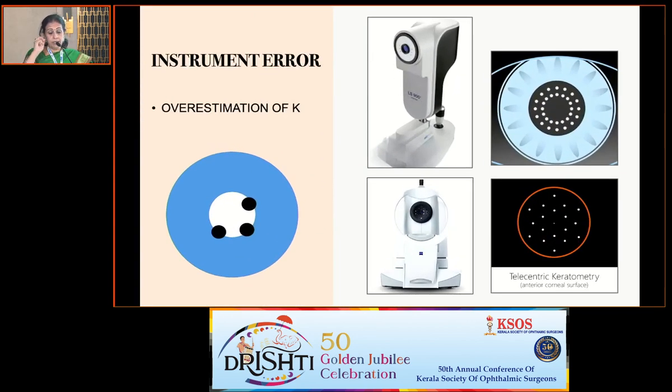The other error is the instrument error. Whether we are using a manual K at 3.2, or an IOL Master with 3 rings, or your Lenstar, you are not able to measure the most central part of the cornea. So all the measurements are paracentral, and you're assuming the central value.